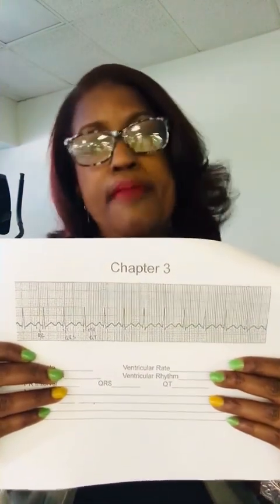Also, another tip is for when you don't just have tachycardia, but supraventricular tachycardia, which I call SVTs, right? You and I, we have to talk the language. If it's SVT, another trick for you is that the patient will not have those P waves. Remember you and I talked about P waves and how predictable they were? In fact, let's look at this strip and I'll show you where the P waves are.